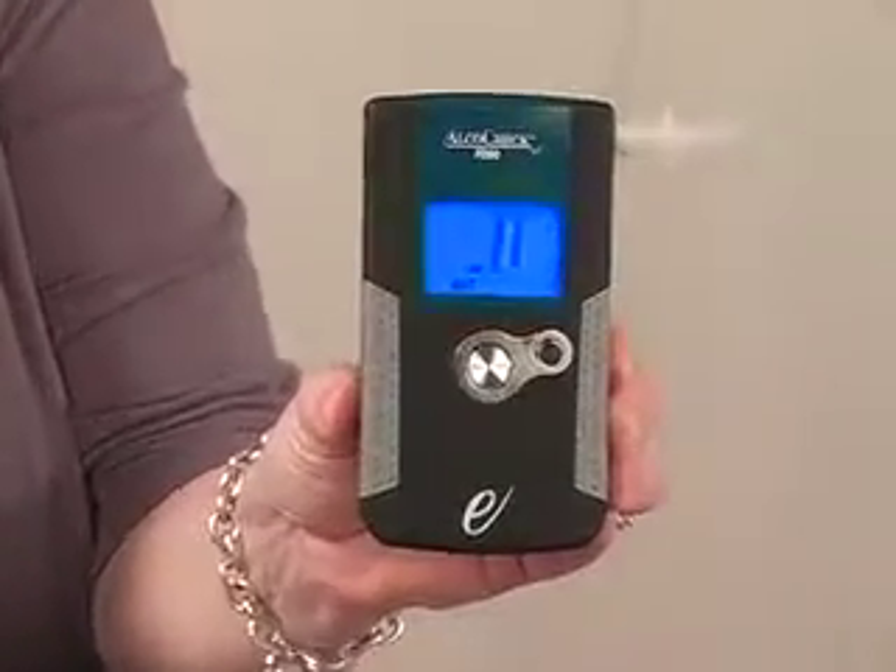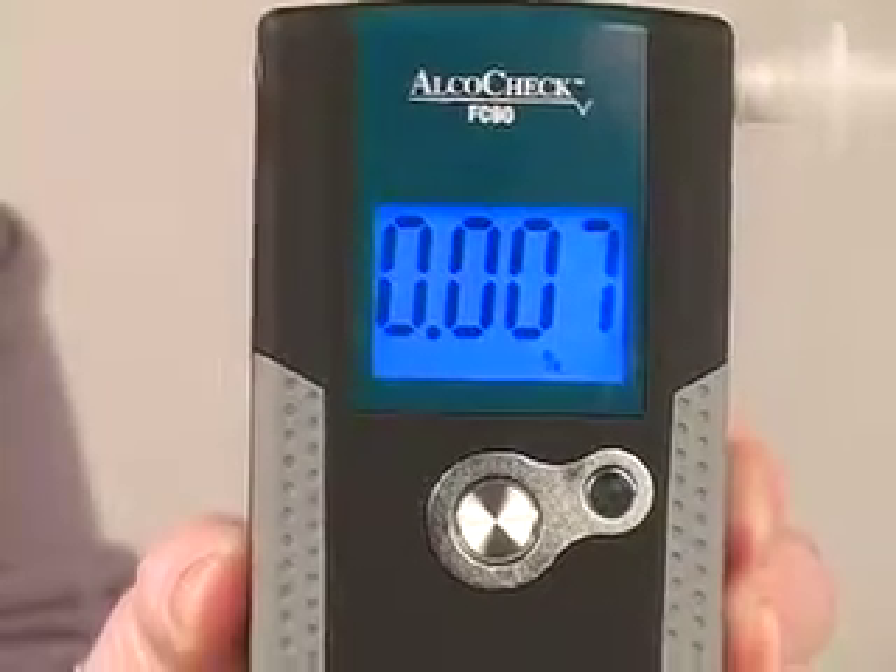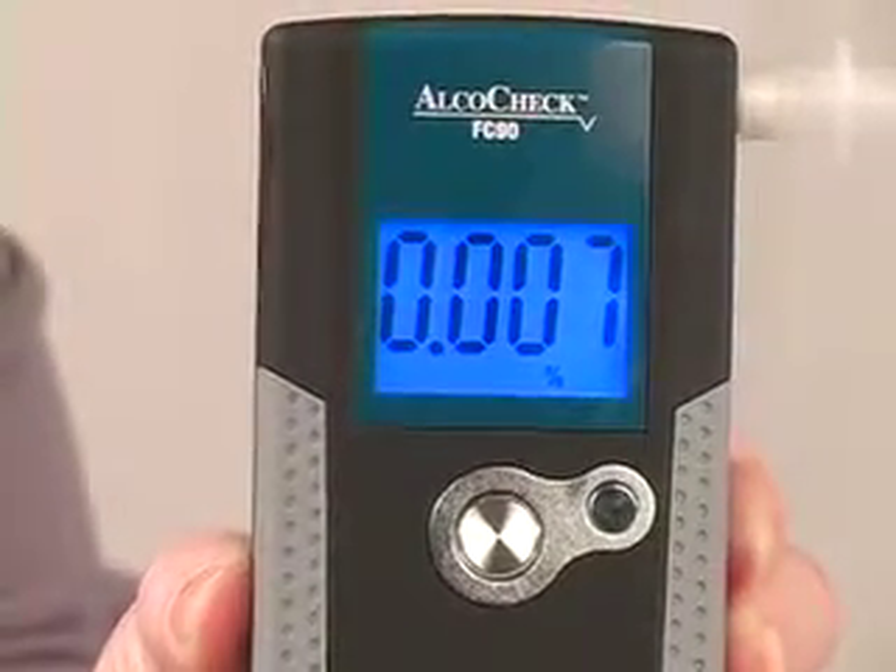The donor hands the device back to the administrator. A zero flashes on the screen while the test runs. The result displays for approximately 15 seconds.